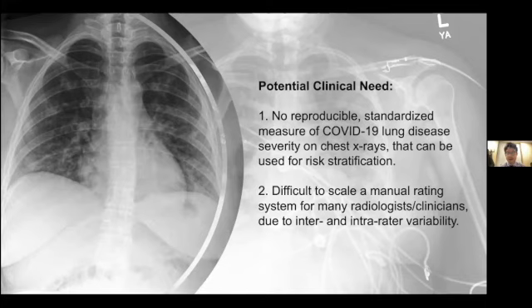An analogous radiology problem for any radiologists in the audience is pulmonary edema. All of us who go through radiology training can recall talking to different attending radiologists, where one person's mild is going to be another person's moderate, and another person's moderate is going to be another person's severe. And so the issue with reproducibility and variability among clinicians is a major problem that's hard to solve without more standardized tools like that AI could potentially help solve.